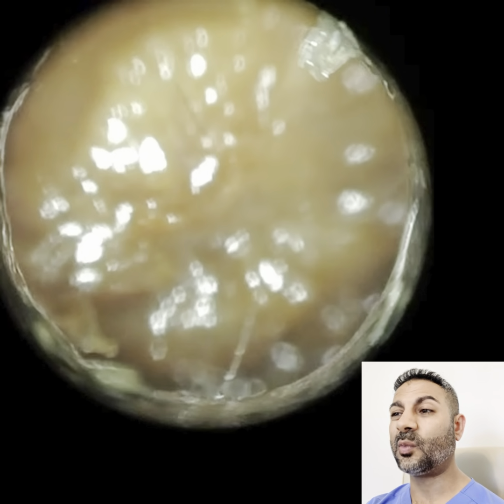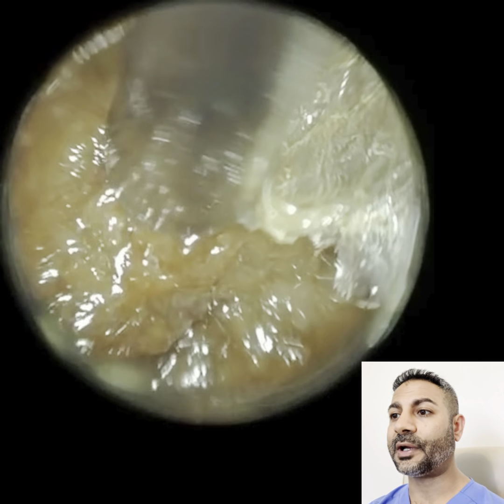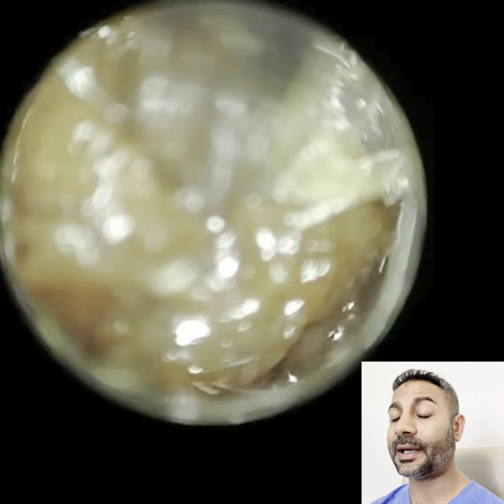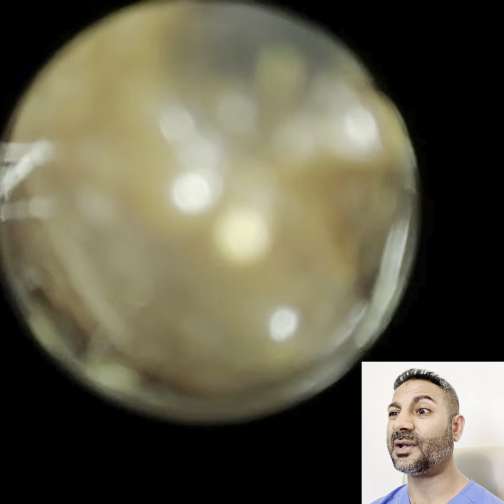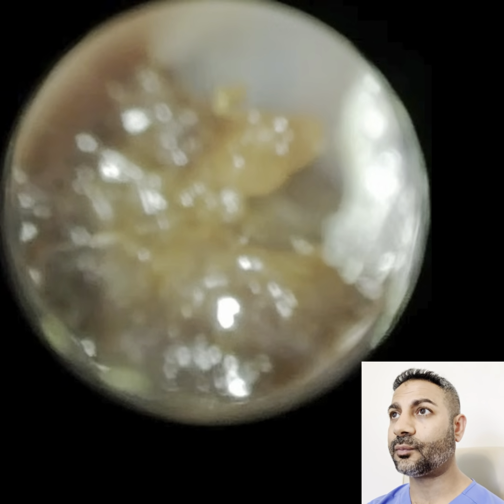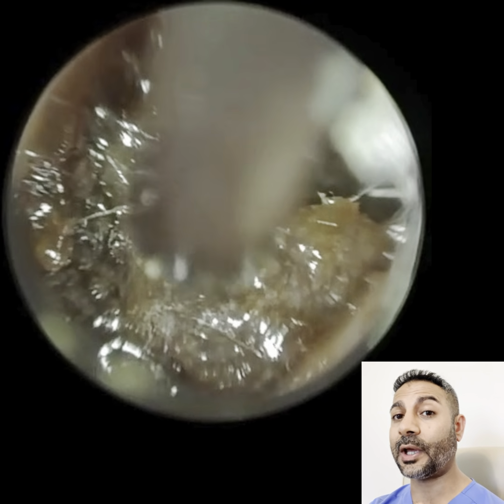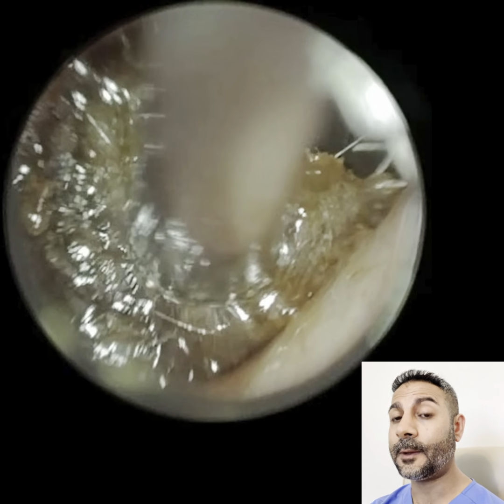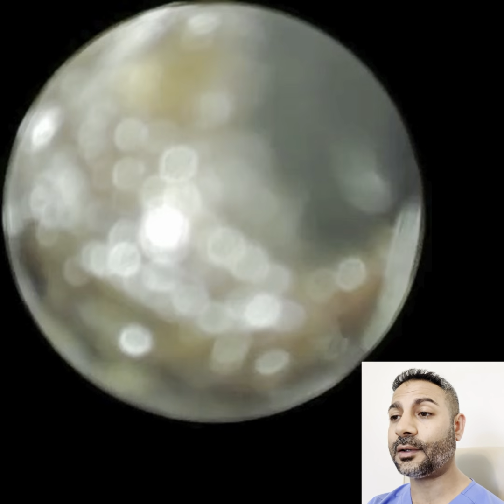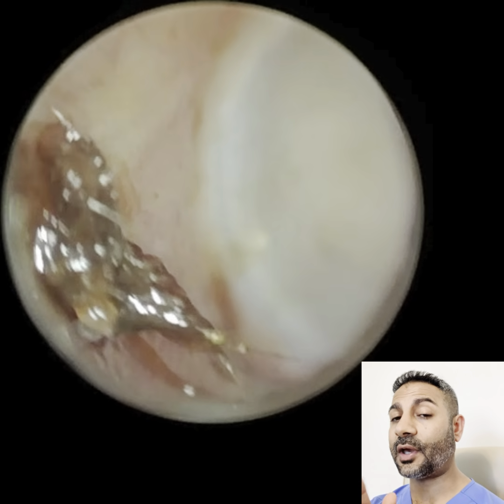We play a sound, we measure the reflection back. If we don't get any reflection back of sound, which is measured by the microphone, the sound is getting through. If we're getting a lot of sound rebounding back, being collected by the microphone, it means the middle ear, the eardrum, is not vibrating as well, it's not absorbing the sound. So we play that sound continuously, and we change the pressure. We're looking at the point where we're getting the least amount of sound reflecting back, because that means more sound is being absorbed. And we measure exactly what pressure that's occurring at.